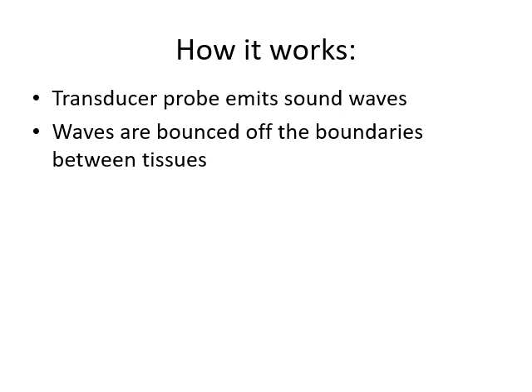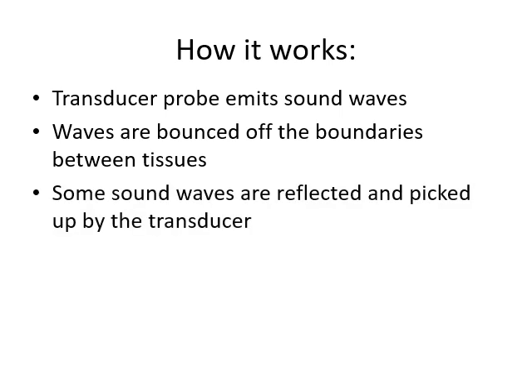Okay, so basically what happens is where we had for x-rays, either the energy was being absorbed by the material or passed through. What happens here is the sound waves are reflected, and they're reflected back, and they're picked up by the same transducer.